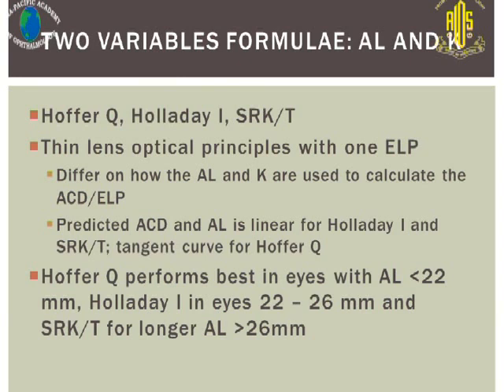The general principle is that the Hoffer Q performs best for shorter eyes, the Holladay for the mid-range, and the SRK/T for longer eyes. And the SRK/T is a very, very good general formula.